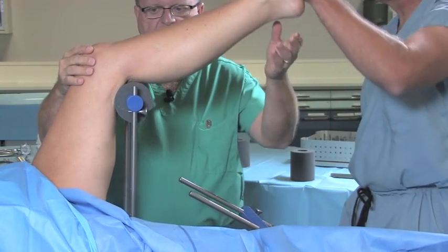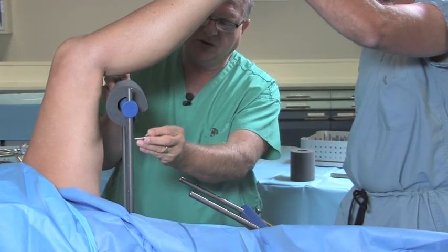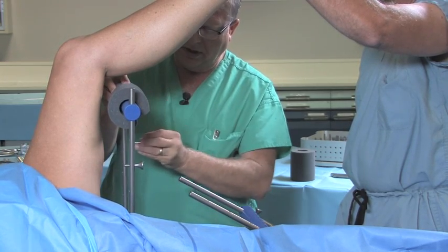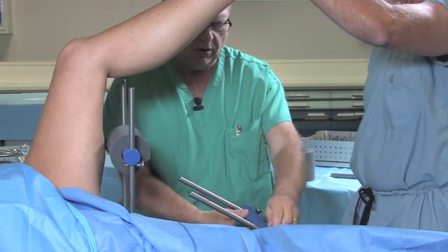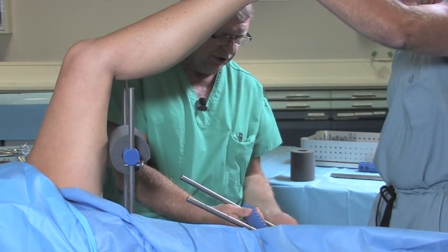First we'll elevate the leg. We'll drop the proximal femoral side down to the number four holes. Then we'll move the foot attachment back up to the neutral position.